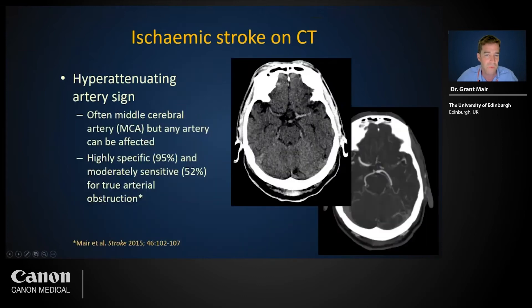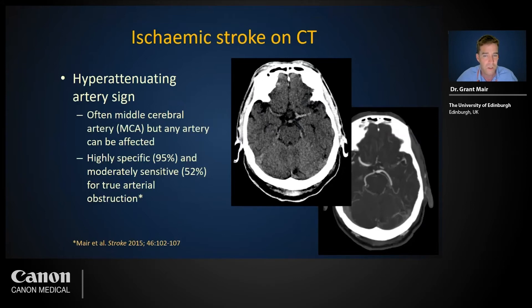The hyper-attenuating or hyperdense artery sign is a highly specific and moderately sensitive marker of arterial obstruction. If present, it is visible soon after onset and is more reliably identified than subtle brain changes. High specificity means that if the sign is present, we can be confident there is a true arterial obstruction, as demonstrated here with concurrent angiography.